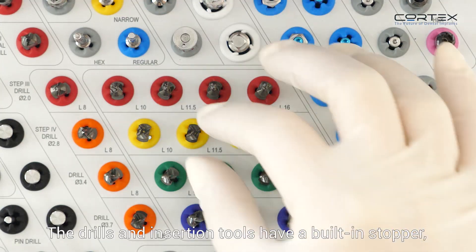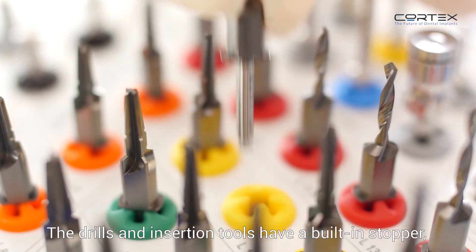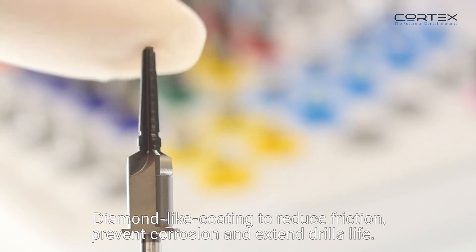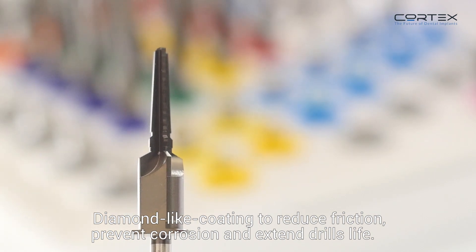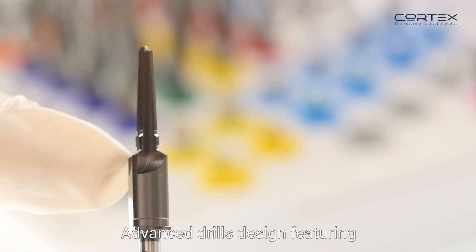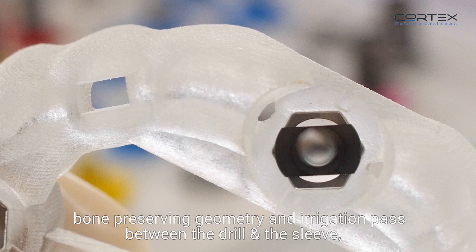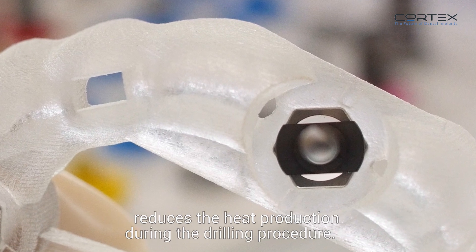The drills and insertion tools have a built-in stopper allowing a fully guided flapless procedure. A diamond-like coating reduces friction, prevents corrosion, and extends drill life. The advanced drill design features bone-preserving geometry and irrigation paths between the drill and the sleeve, reducing heat production during the drilling procedure.